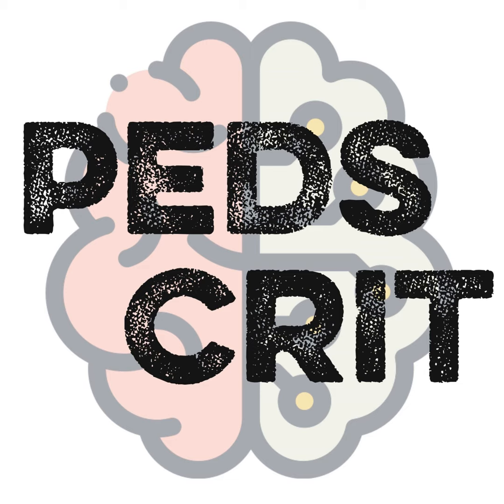We also pay attention to what happens, right? Like, okay, if you clamp and then the patient becomes hypotensive, you escalate the drips, treat the patient as they need. And then if they are awake, give them some sedation and make sure that they tolerate all of this. Based on your blood gas, adjust the ventilator if there is a ventilatory problem. So concurrently also treat the patient, pay attention to their heart rate, CVP, all of those things.